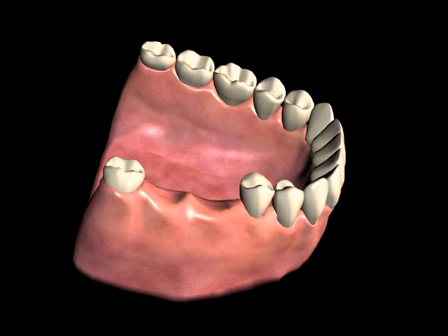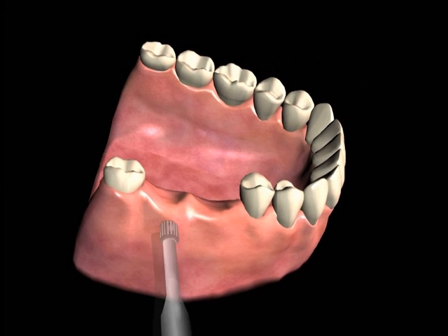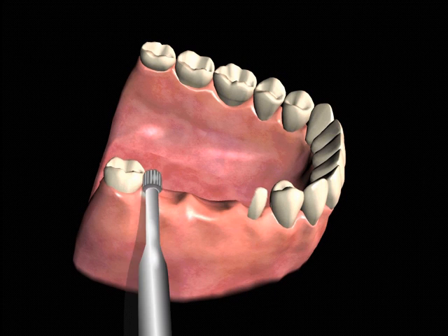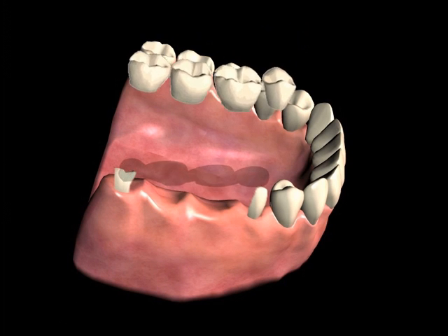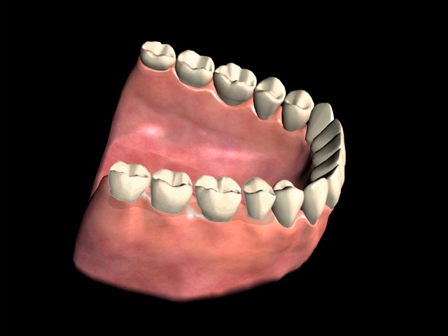A fixed bridge relies entirely upon a foundation of the teeth immediately adjacent to the missing teeth. The neighboring teeth that are going to be used as anchors are reduced to make room for caps or crowns to be fit over these anchor teeth. These caps or crowns will then be made to attach the artificial teeth, all as one unit.